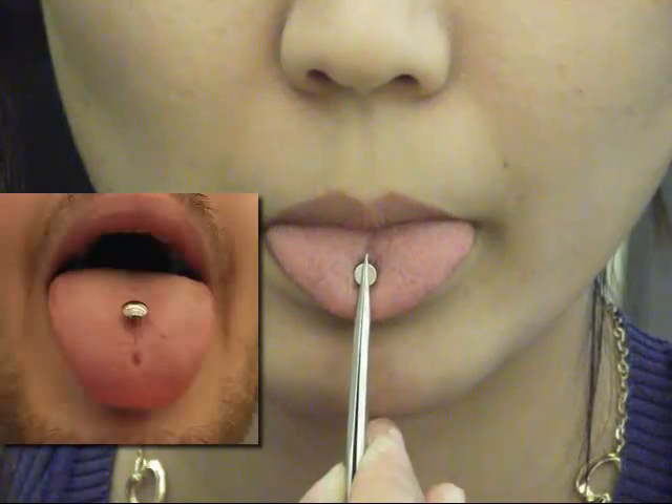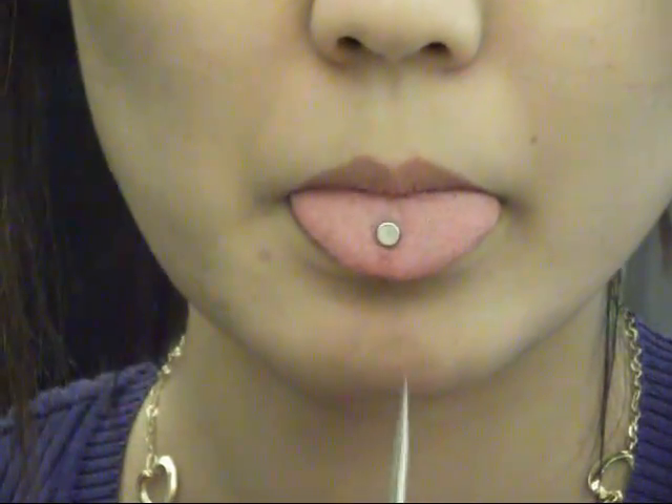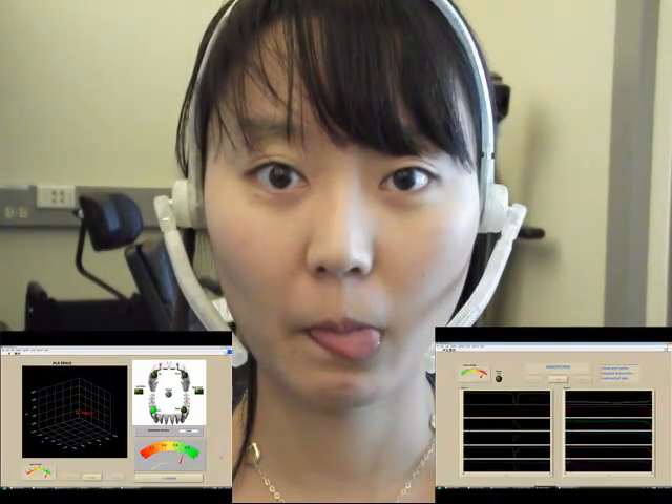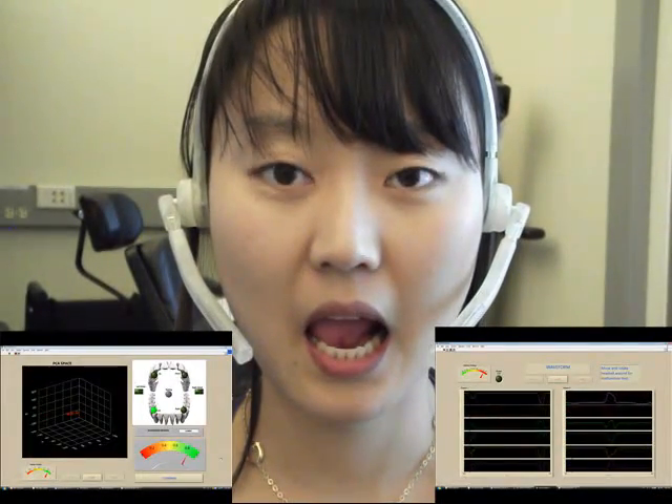Now, Zhanghi will show us a live demo of the tongue drive system. First, we temporarily attach a magnet to her tongue using a special type of glue. The sensor outputs change when she moves her tongue.